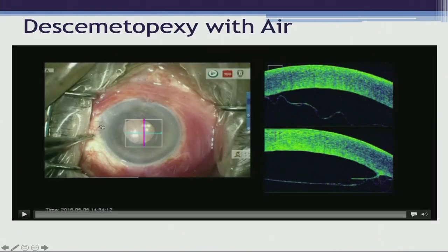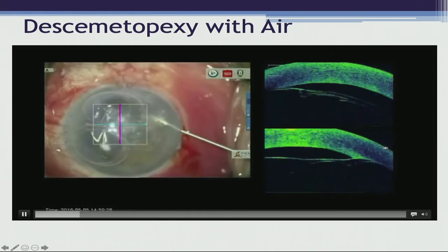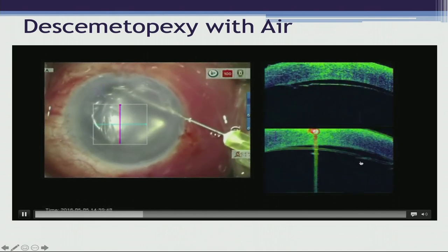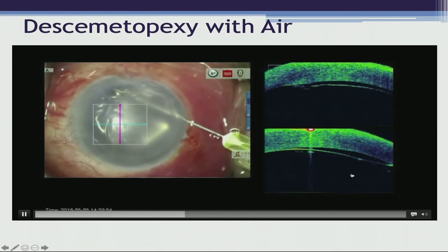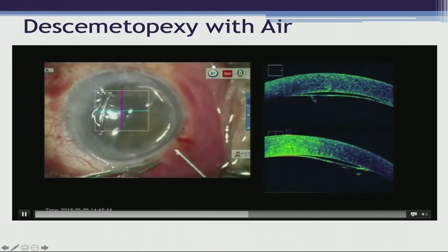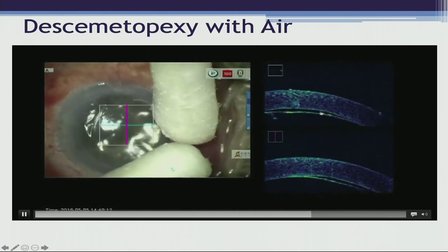Now, this is just to show various surgeries in which it can be used. If you have a Descemet's membrane detachment, such as here, which is a very large one, and you inject the air bubble inside, then you can see that the Descemet's membrane detachment is still there, but it is shallow. If I didn't have this iOCT, I would probably think that I'm done, but actually I'm not done. Another important indicator is that as you put in this air bubble, it becomes clearer on the table itself, and when you take out the needle, again you see that there is a shallow Descemet's membrane detachment.